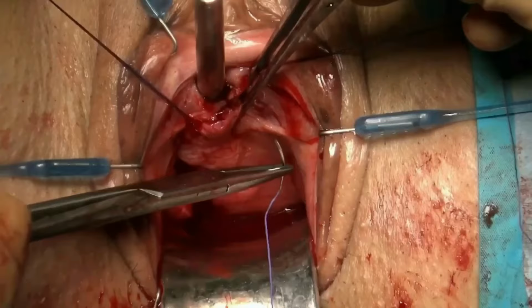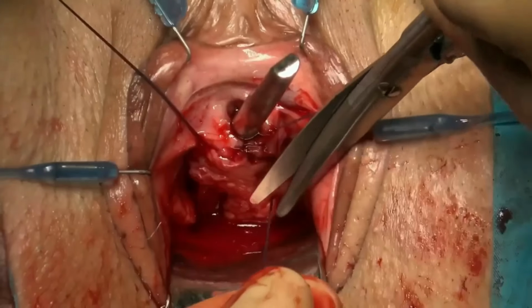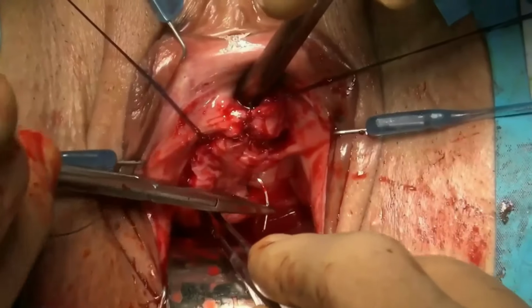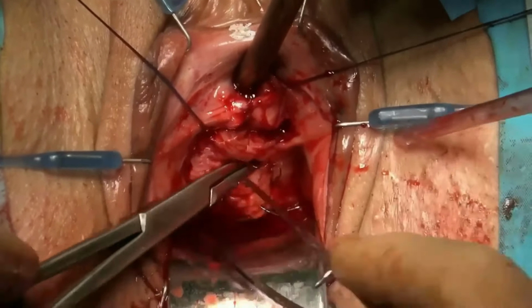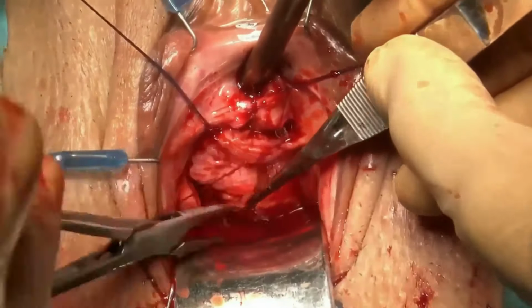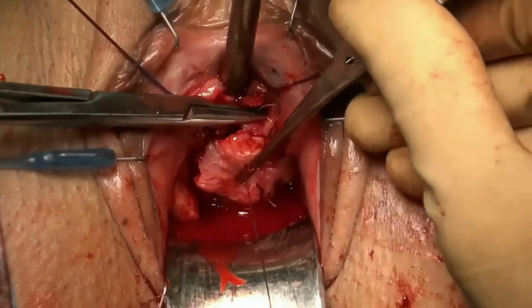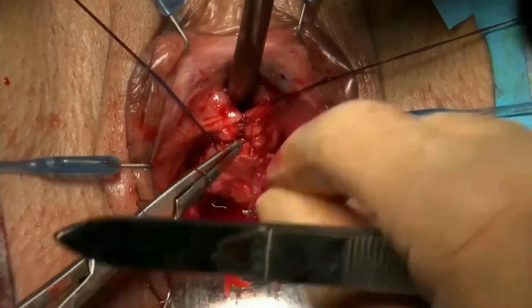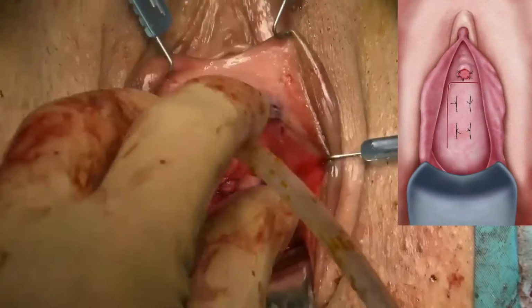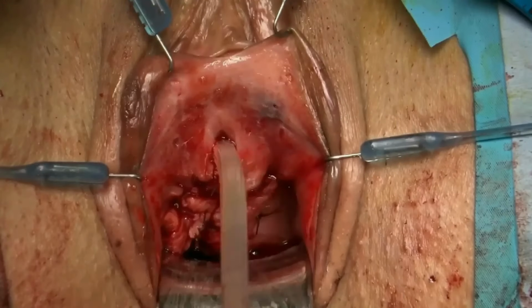A series of quilted stitches with 3-0 polyglactin suture are made between the vaginal wall and periurethral fascia in order to avoid bleeding and hematomas. Reconstruction of the vaginal wall. A 16-French silicone Foley catheter is left in place for 4 weeks.